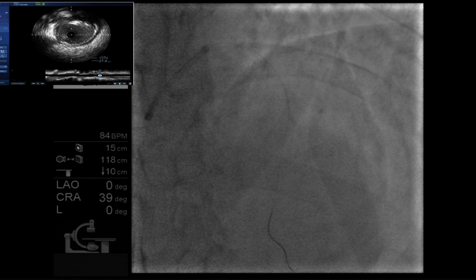What do you think, Dr. Mamas? It's very situation specific, as I mentioned earlier. For certain cases I'd use IVUS, but the majority I'd probably use OCT. I think the main discussion is whether you should use imaging, and in my view, you should, for most cases. The information I got is very important, so I can dilate it with a balloon comfortably. I pick the right stent size and length, and after that we do a post-IVUS to see how the stent is doing, and we can finish one lesion.